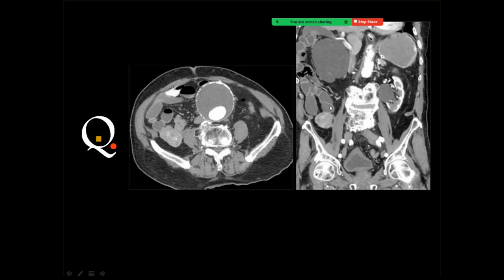If it is in the bowel, the first possibility should be GIST tumor. Then the other alternative for the diagnosis, as I have mentioned every time in the lectures, is that you should mention the primary lesion in this particular area to be followed by lymphoma and metastasis. Everywhere in the body, these three possibilities should follow each other.